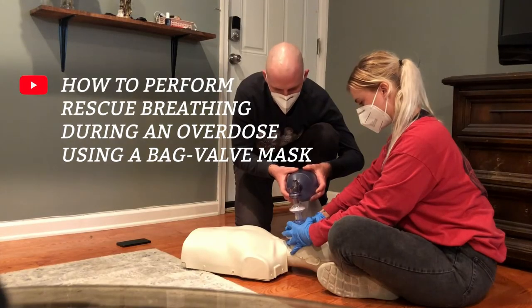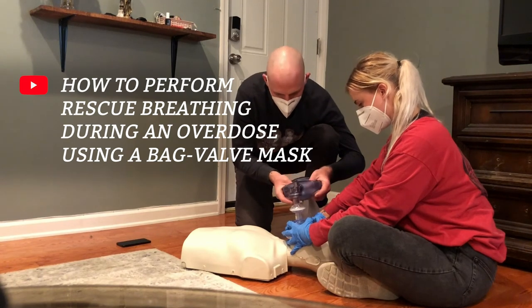Be sure to watch the full video on how to perform rescue breathing during an overdose when using a bag valve mask. In it, you will learn critical information about how to get a proper seal, what to look out for, and when to stop.